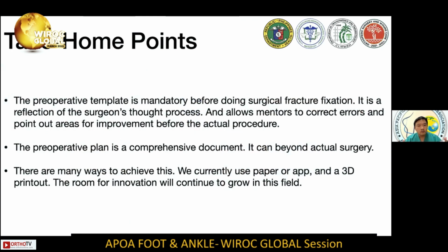So to take home, to summarize, I would like to state that pre-op templating is mandatory. It is vital when you're doing surgical fracture fixation. And it's really a reflection of how the surgeon thinks, and it allows the mentor to tell the students what his errors were in his chronology or sequence of surgical planning. And you get to correct mistakes even before actual surgery is done so that you can further prevent harm for the patient. The pre-op plan is a comprehensive document.